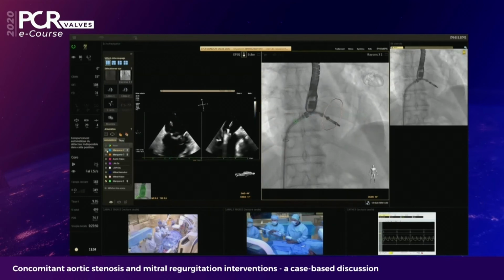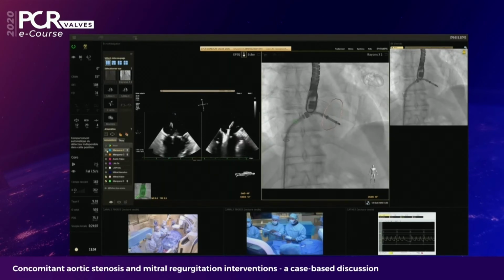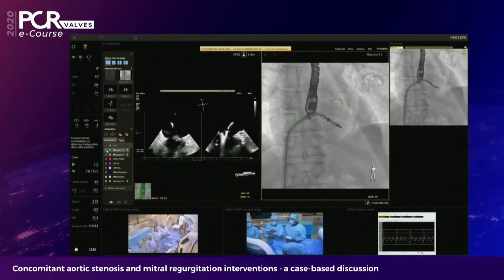Okay, so we're going to dive in the ventricle now, slowly. The clip is a bit closed when you dive in the ventricle, of course. It's opened again. We are pulling gently back to the annulus. You can see that the posterior mitral leaflet has started sitting nicely on this clip, partially open. We're going to check that the anterior also is okay. The medial and lateral are okay.